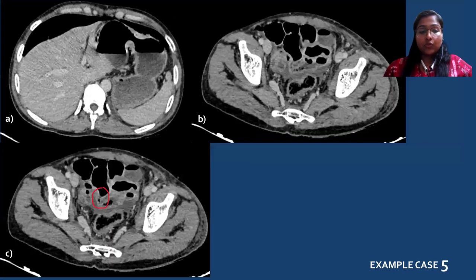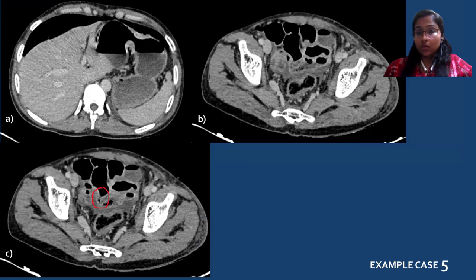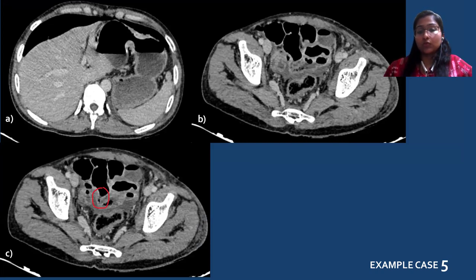This was a case of a 45-year-old male who presented with blunt abdominal trauma. Free air can be seen with a collection with air foci along ileal loops. Further, a rent or discontinuity could be visualized, which was confirmed intraoperatively.